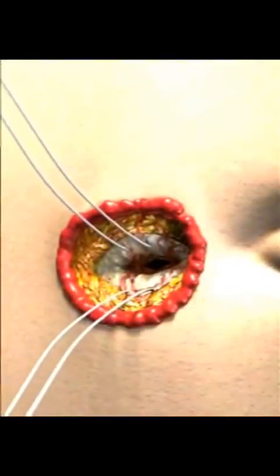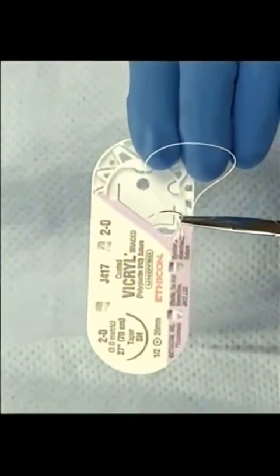The fascia can be closed by tying the 2 stay sutures together at the fascia level. If this is not sufficient, additional sutures may be placed. The skin may be closed with either sutures or staples.